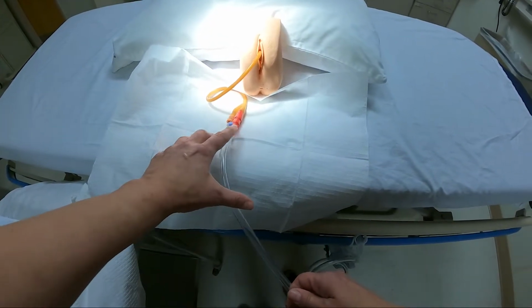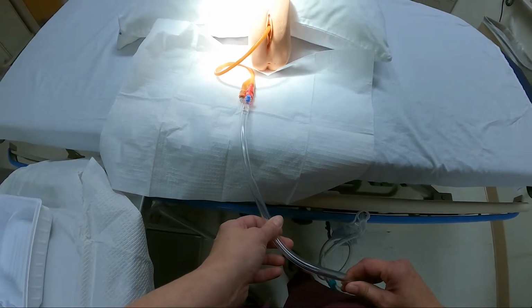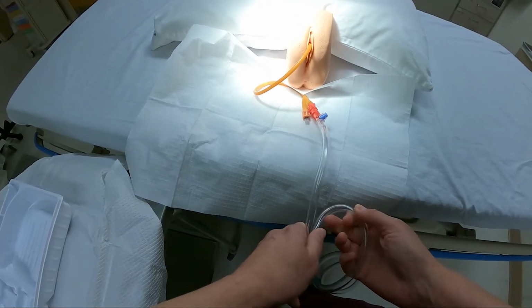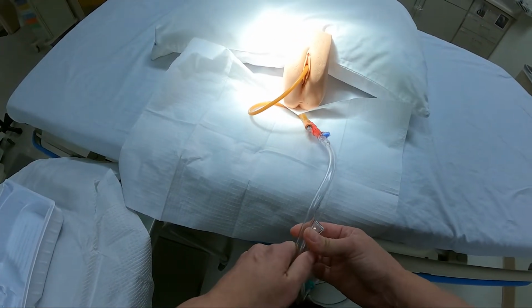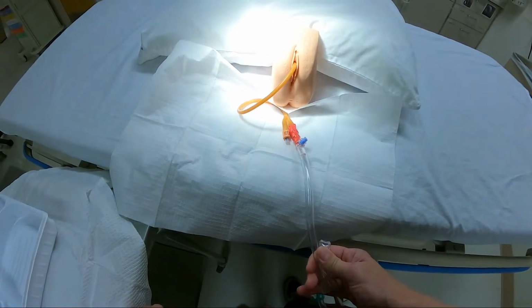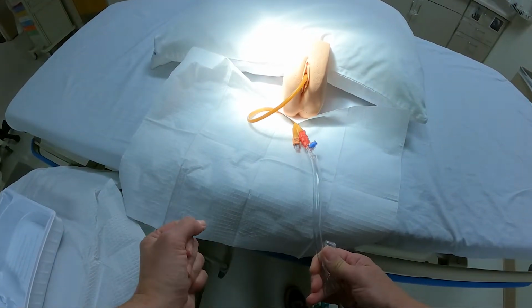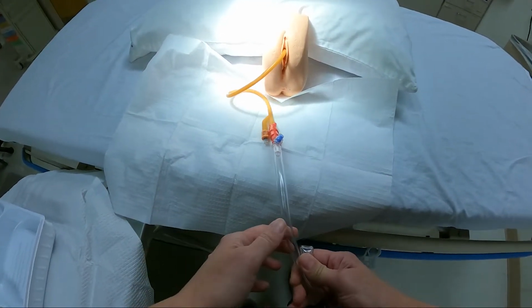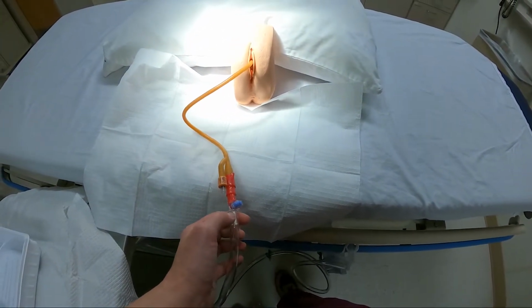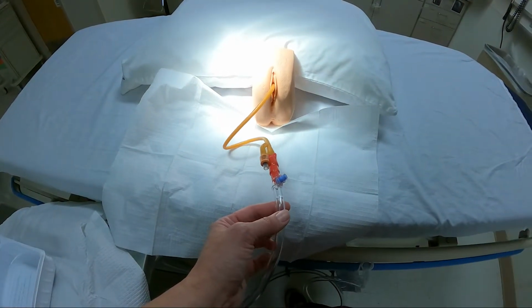Sometimes you don't have enough urine sitting in the tube to get your sample. Sometimes they have enough output, so it doesn't matter. Should you need to, you can use a catheter clamp or some other device that temporarily holds the tubing like that, just so you can get enough. Don't walk away and remember it 6 hours later, because it's backing up into the bladder, and urine is a great medium for bacterial growth. So, having done all those steps does not guarantee no urinary tract infection, but it does minimize the risks.